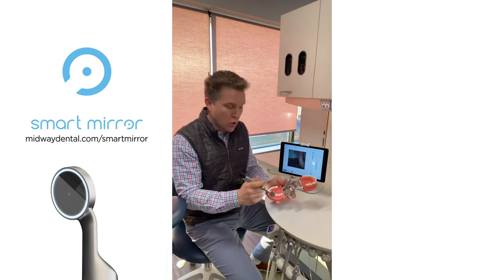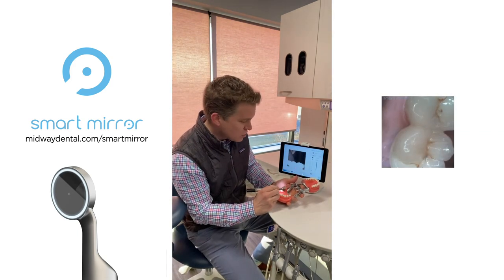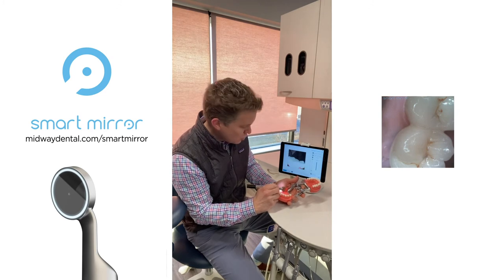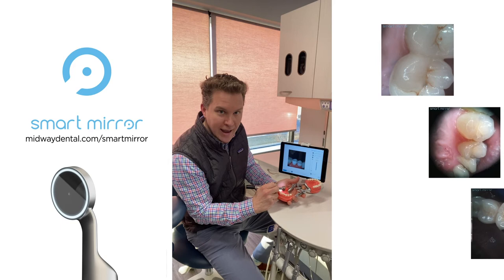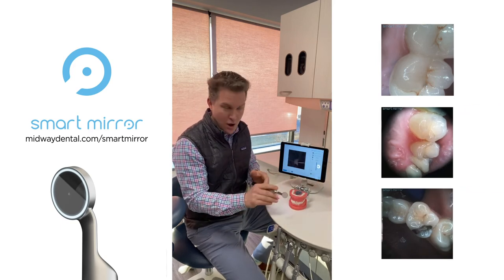From an imaging quality perspective, the image quality is phenomenal. I can get super close to the tooth structure, I can go far away, I can capture still images, and I can create videos.